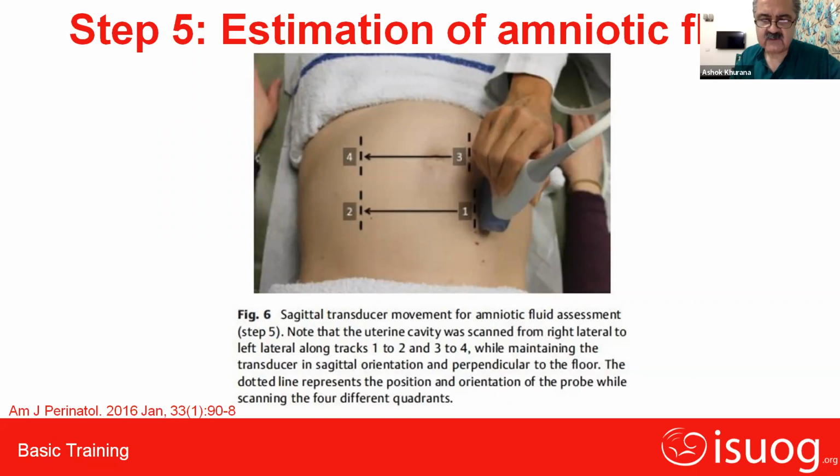that you actually visualize. In order to visualize, when we move our transducer, we must make sure that we always hold the long axis of the transducer along the long axis of the patient, and that we don't turn it into a transverse axis. We must do it exactly as shown in this diagram, and only then can we quantify this in a consistently reproducible and reliable manner.